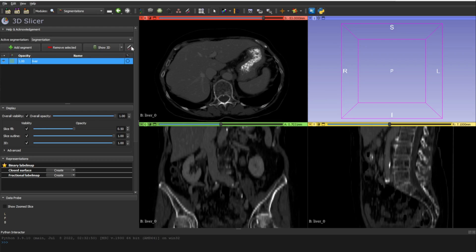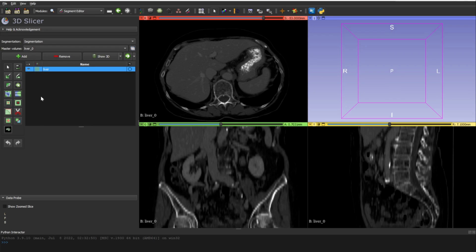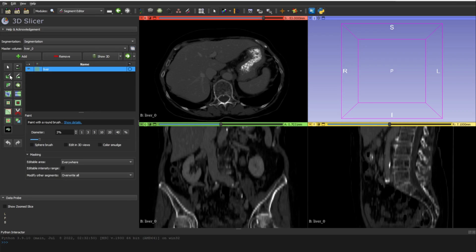To do the segmentation, go to the Segment Editor. You'll see multiple tools available for annotation. We have three main tools for manual annotation. If you want automatic annotation, you can include deep learning models from MONAI or NVIDIA servers, but for now we'll talk only about manual segmentation. Let's start with the brush tool.